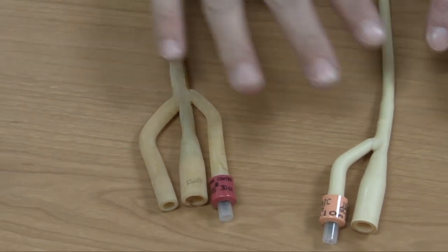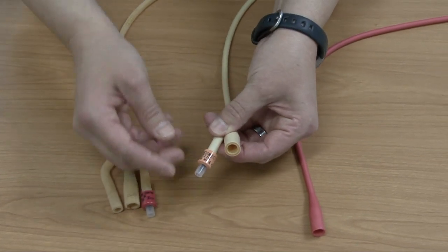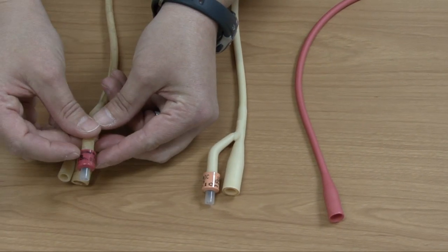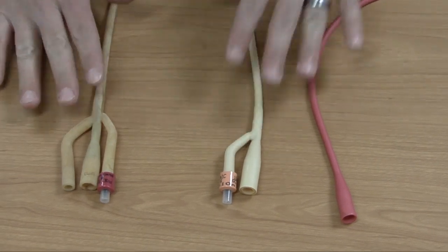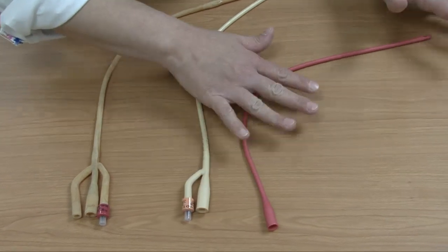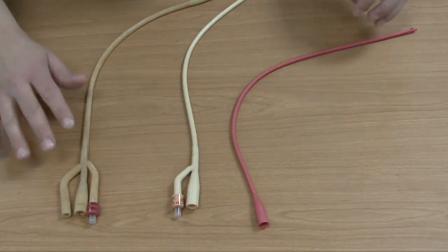Always make sure that you look at your packaging and know what type of catheter you have, whether it's a 16 French or an 18 French, and how much you need to inflate the balloon with — or if you're going to use a catheter that does not have a balloon, which means it would go in, you would drain the urine, and it would come straight back out.